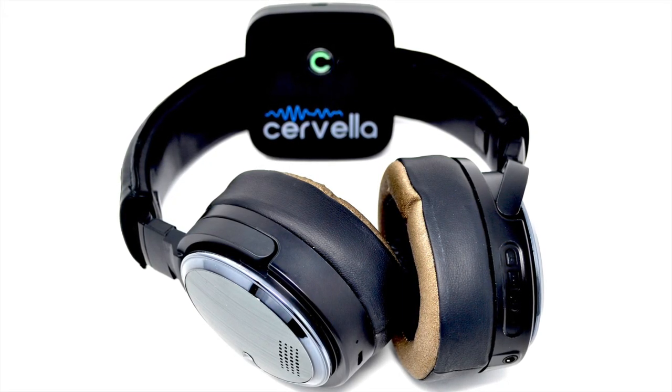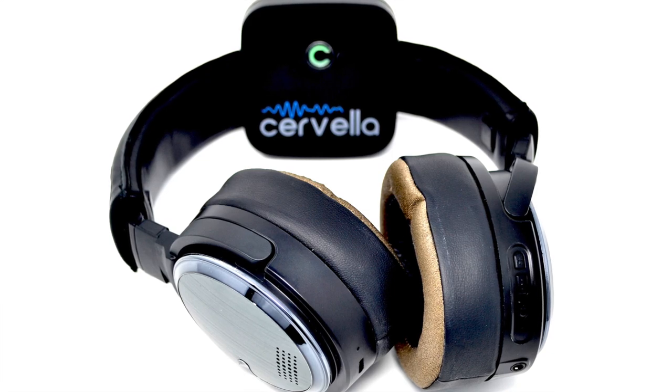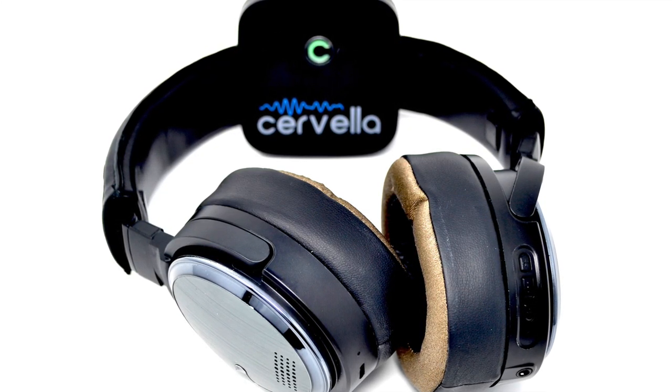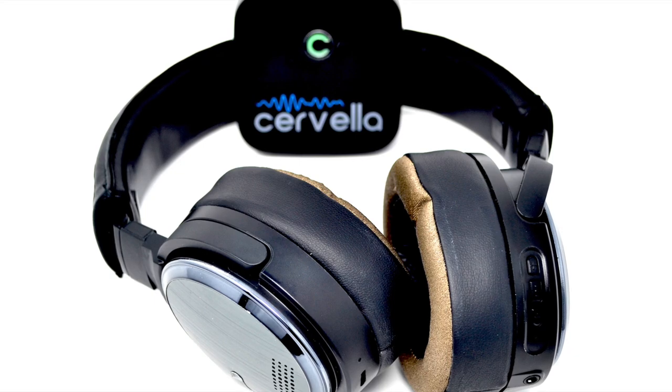If you need to pause the treatment, simply remove the headset. Cervella will automatically resume the treatment when it detects good contact between the electrodes and the patient's skin. If you need to stop the treatment, tap the circle area on the app and the treatment will stop and the timer will reset.